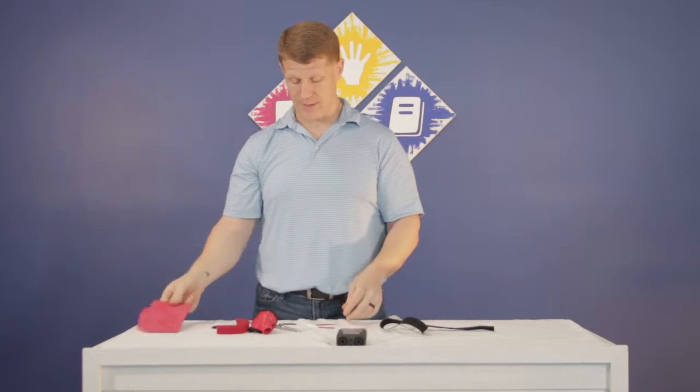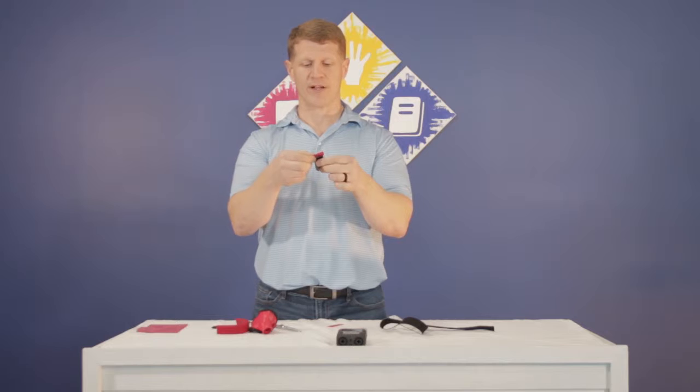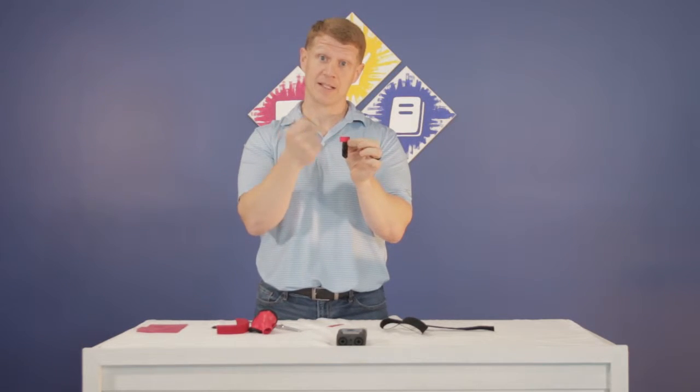I'll put that in the heat. I'm also going to put these two extra pieces in the heat to use as tags — I'll put them over the Velcro edge so every time the patient pulls the Velcro off, they're not pulling that Velcro edge off. I'll use a little solvent to make sure it glues on there. That works really well to make sure they don't have to come back to get new Velcro stickies.